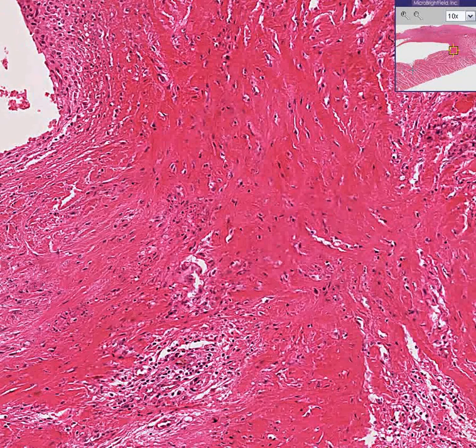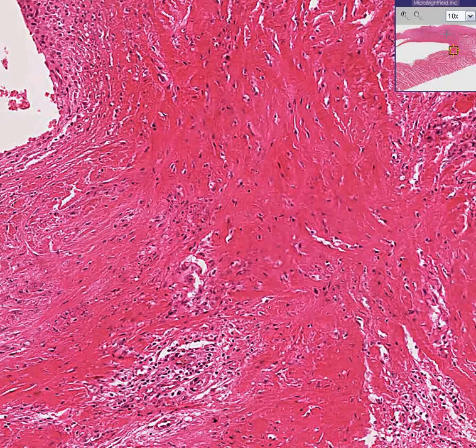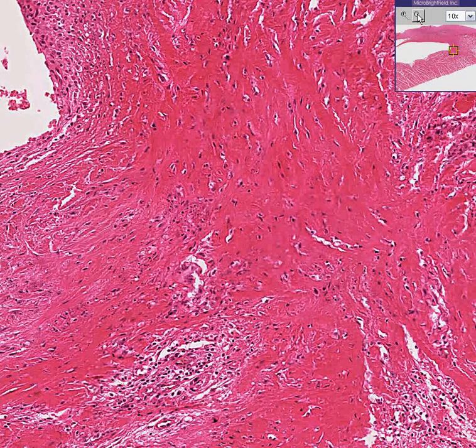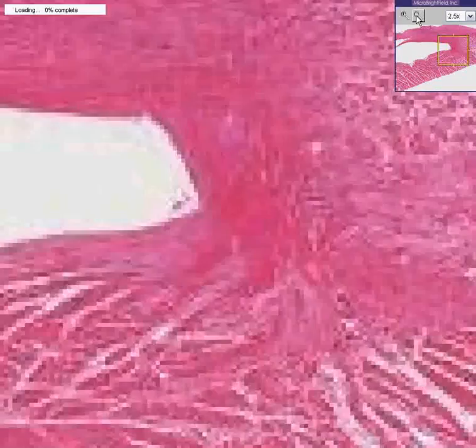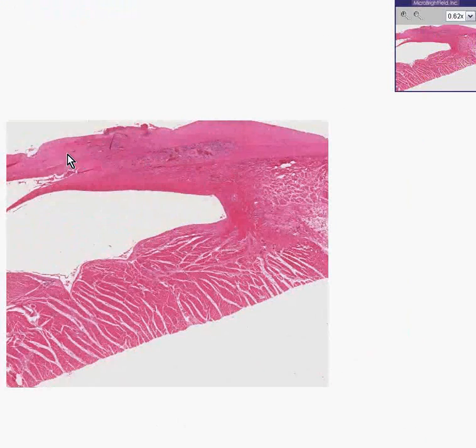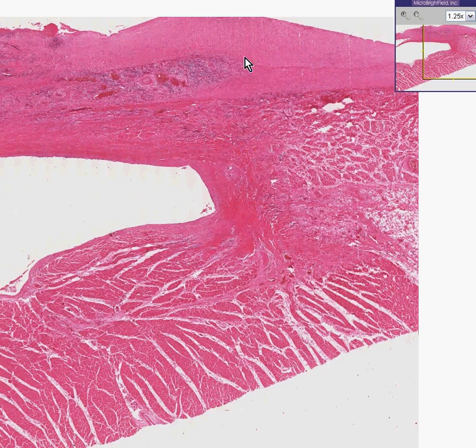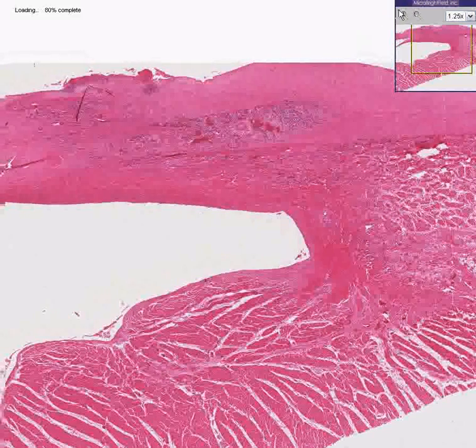If you look up here in the north east corner, you could see this lower area is primarily myocardium and the upper area is primarily a valve, which is a specialized type of endocardium. Here's a valve, here's myocardium. The primary destructive process going on here is in the valve itself.